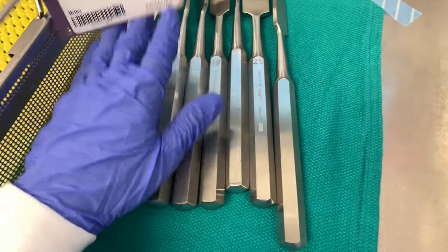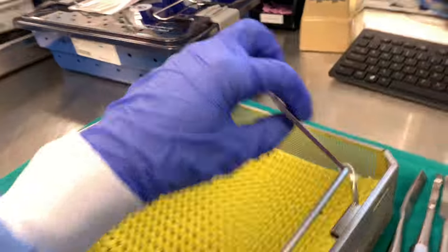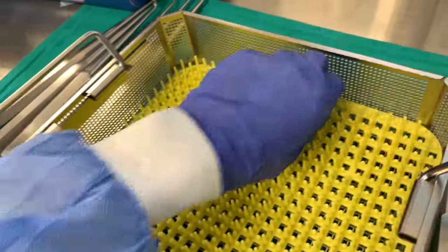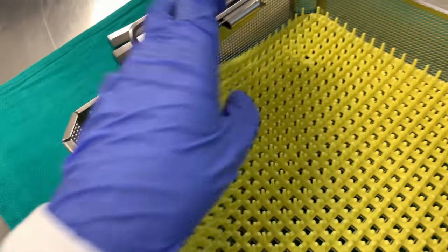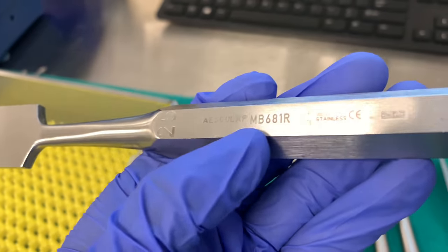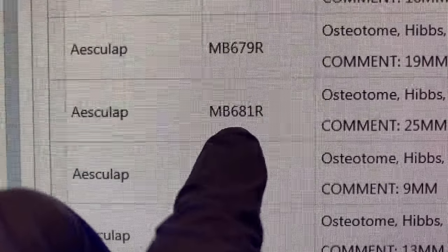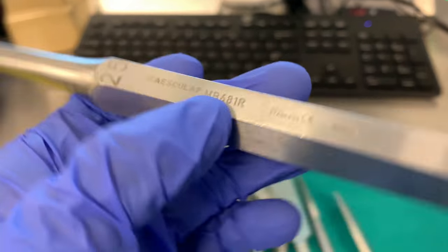So I spread everything out right here. Make sure nothing is in the bottom of the tray — make sure it's clean. Sometimes when it comes out of decon there's some stuff, like some blood, you never know, just check. Usually each instrument is going to have a bar code right here. This one is 681R, so that's the one — then you just check it.